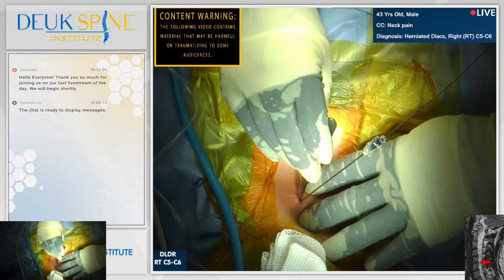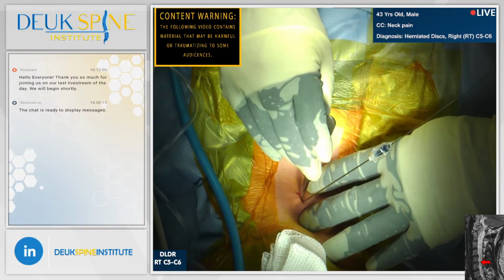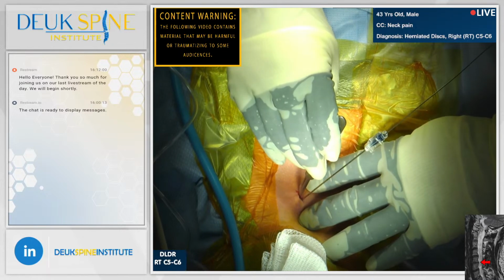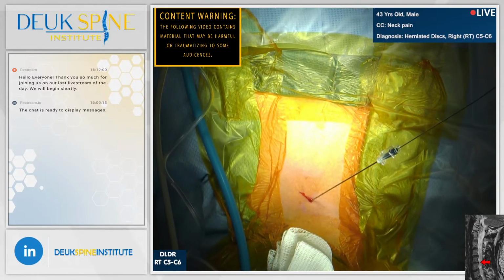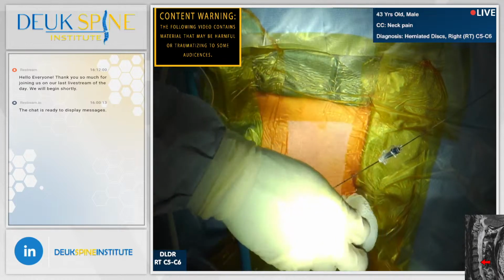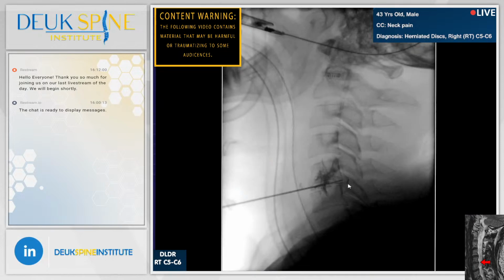Welcome back. You can see from that video right there that the actual cause of all the symptoms is inflammation happening in the back of the disc. Now, take a look at this x-ray here. Jordan's going to show you the herniation. You guys see that black line there? That is the herniation sticking into the spinal canal. Beautiful. Did you get that?